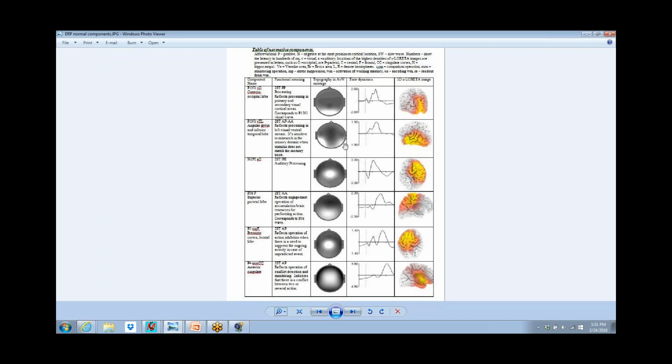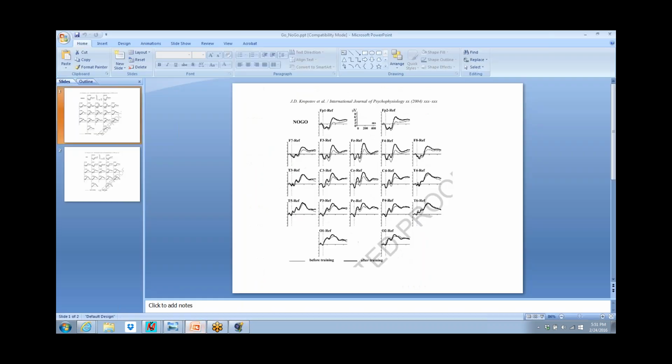You still have to figure out what the hell you're looking at. This is the auditory detection. This is the motor engagement. If this was a go stimulus and you hit the button, this is what did it. If you inhibited and didn't hit the button, this is what did it. And this is the self-monitoring component, which tells you if you made an error or not. It holds in the anterior cingulate a model of what you should be doing, and you compare your current behavior to that. If you get an error code, you get this component firing off. And step by step by step, this is the processing, and the adding of these waveforms together is what gives us these raw waveforms.